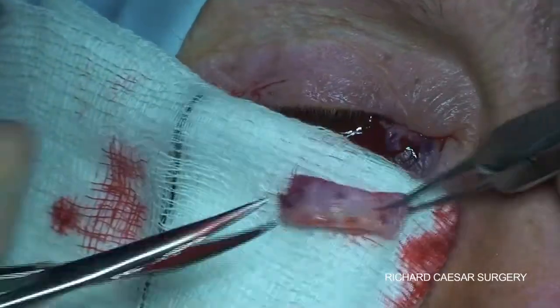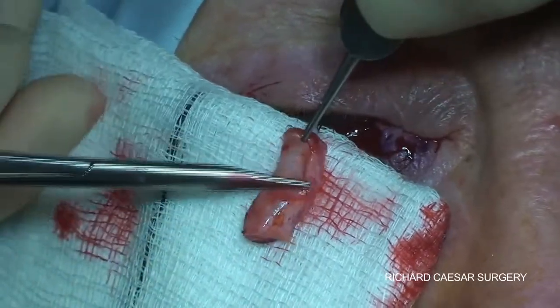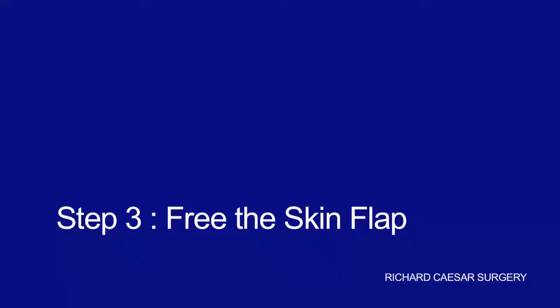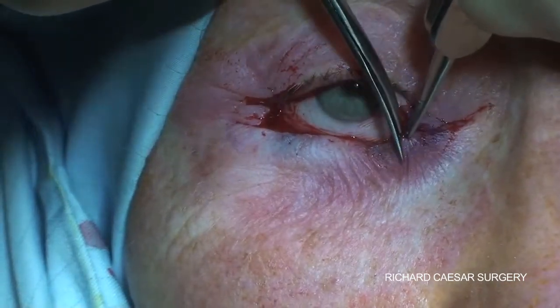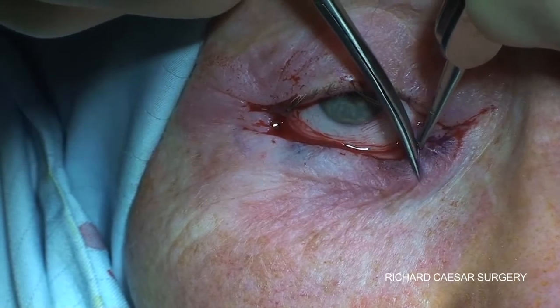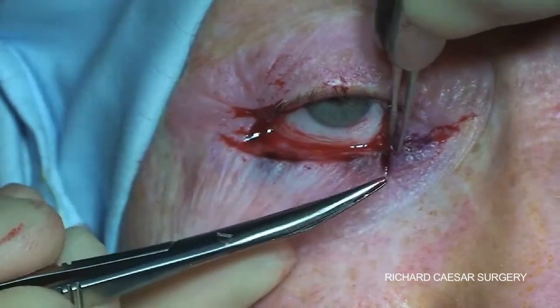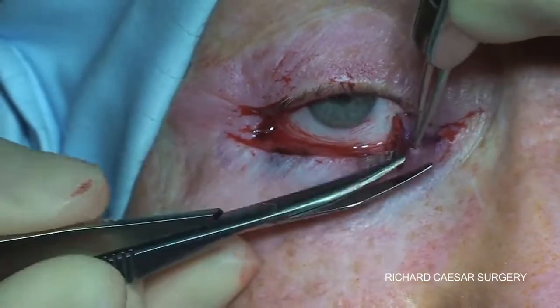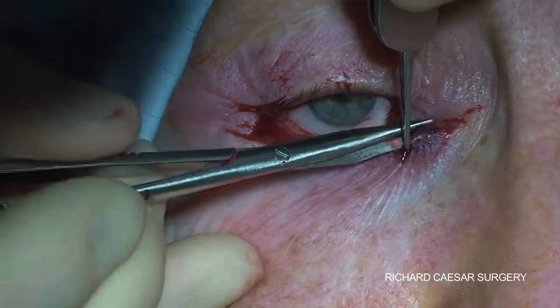Once the lesion is off, it's nice to check anterior and posterior and confirm that you have excised what you thought you'd excised. The next step is to free the skin ready for it to be advanced, so the two Burow's triangles are excised from each side and then the skin is simply undermined to free it up and enable it to advance.